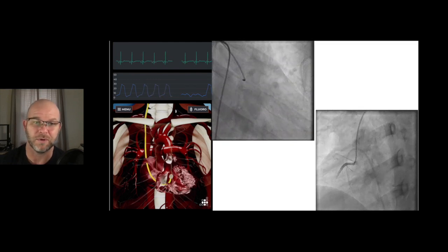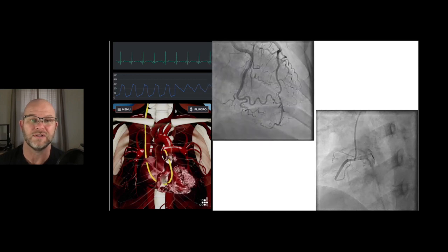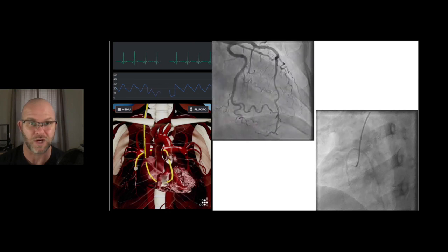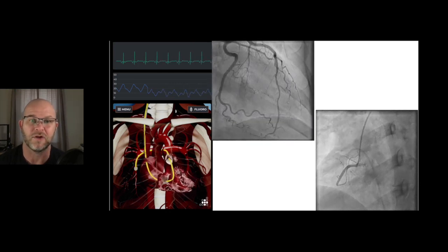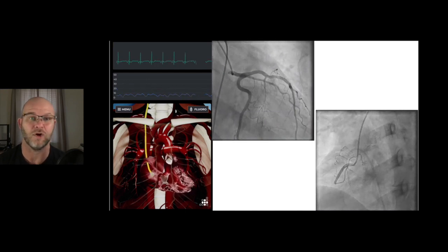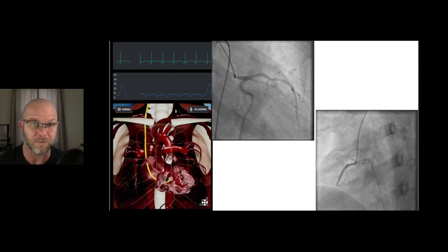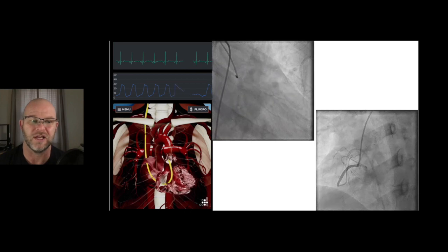But you also may be someone who's looking to get into cath lab work, or someone who is sending their patient to the cath lab. From EMS, the most direct route into the cath lab is via a STEMI, which we've talked about in other videos. But if you have an ER patient, or you are on the floor getting your patient ready for a heart cath, what does that actually mean? How are you going to educate your patient?